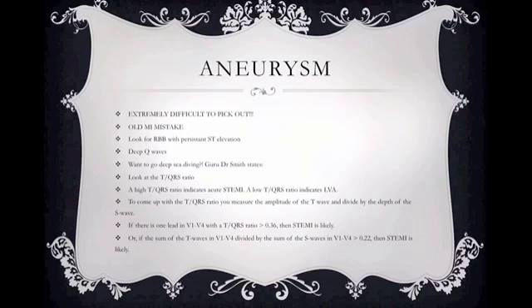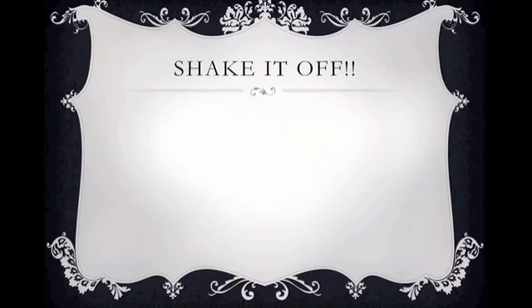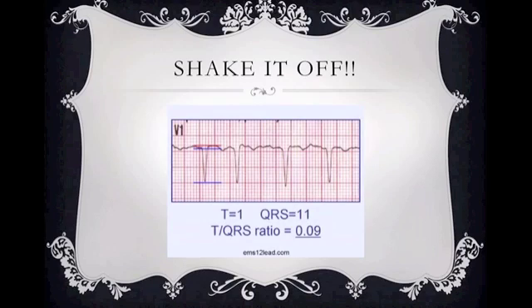Are we going to remember it? I have no idea. It all depends on how passionate you are about EKGs. But let's look at some examples, all right? So shake it off. Shake it off. Dr. Smith is the man. We only walk in his shadow. So let's look at what we're talking about here.